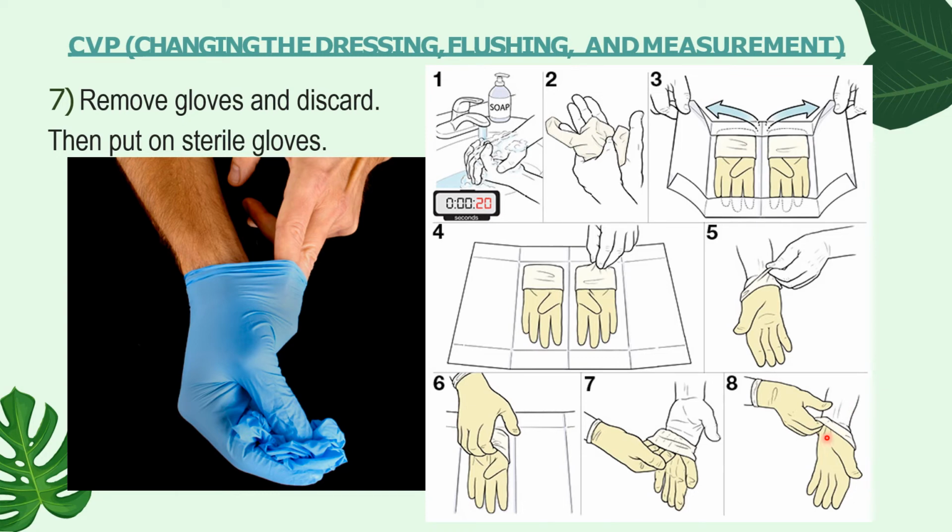You are only touching the sterile part of the gloves, because if your thumb will touch your skin, you will now be unsterile. So you have to be careful that your thumb or your other fingers should not touch the skin of your client. So remember to use your skin to skin, okay, skin to skin pre-procedure, and then glove to glove technique.